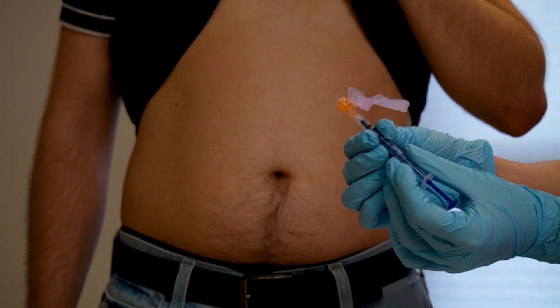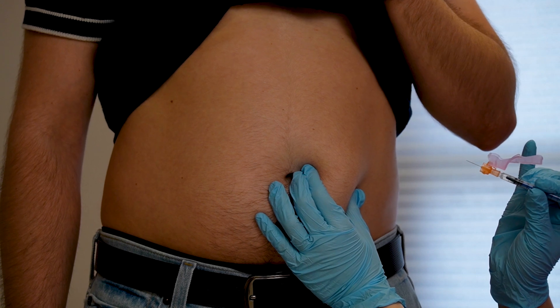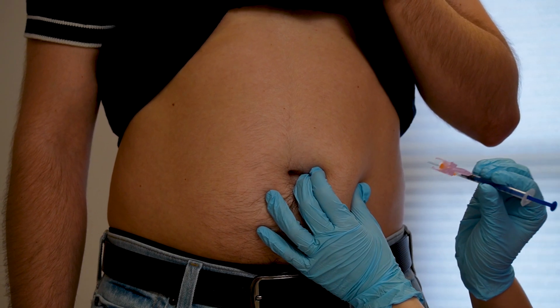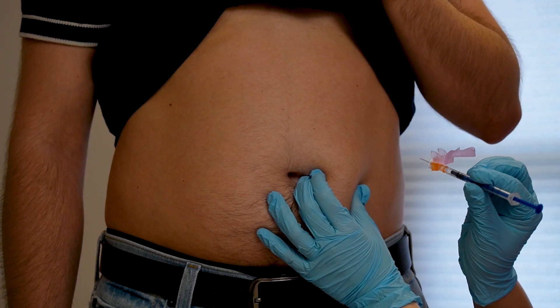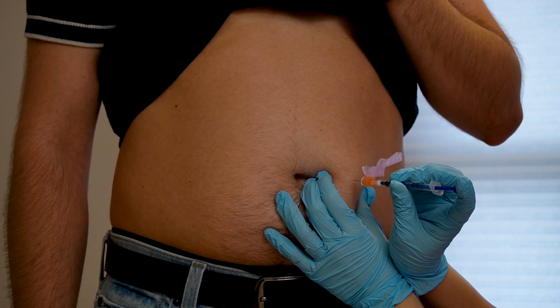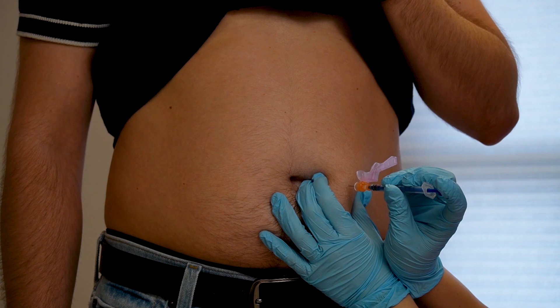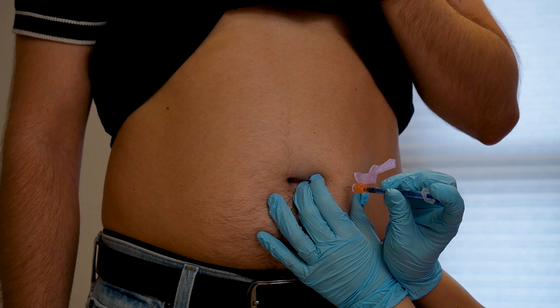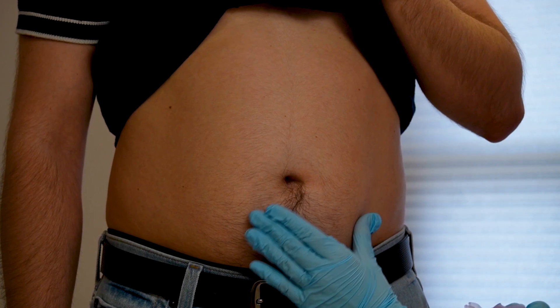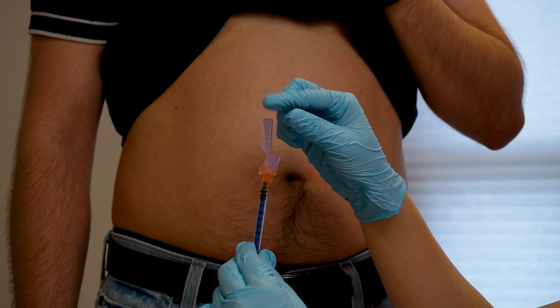Take your non-dominant hand and pinch the skin. Because we're doing subcutaneous injections, we want to make sure we're getting into the fatty tissue. Don't pinch too narrowly — pinch more widely so you don't inject into muscle. Using a dart-like motion, inject right where you want it to go, and use your index finger to push the plunger. The medication is very thick, so don't do this fast — inject very slowly. Count one, two, three, then remove the needle, and only after that release the skin. We're done with the injection. Use the safety tool — click — so you can't harm anyone.